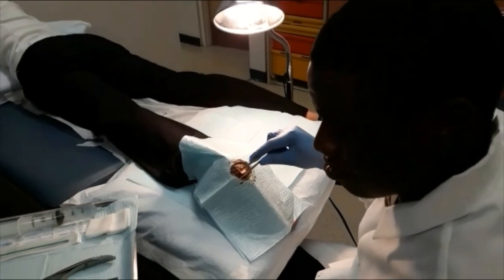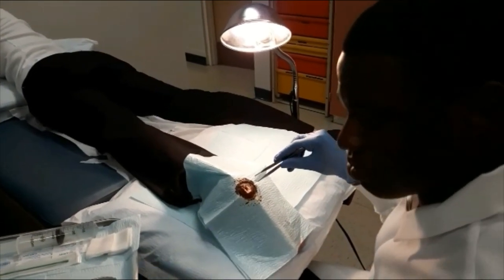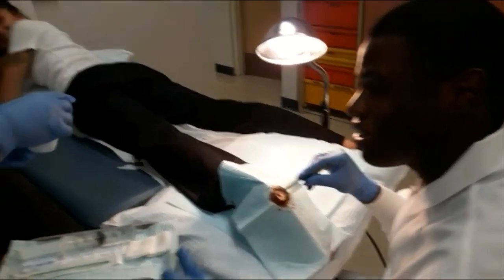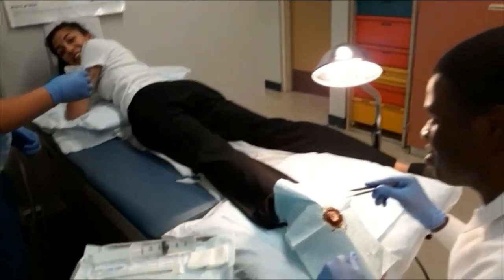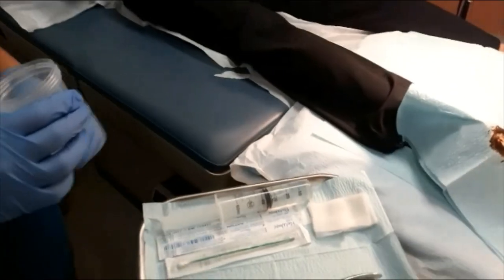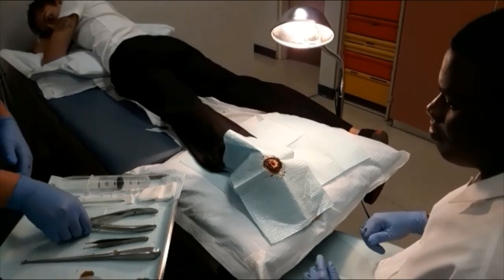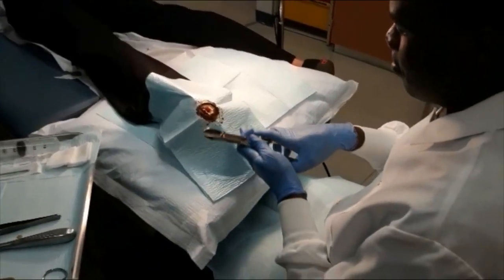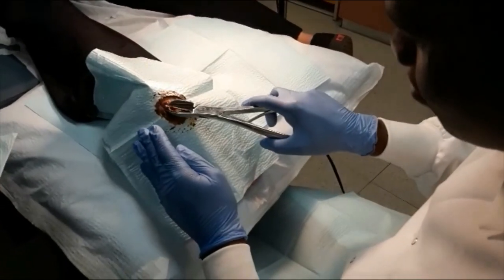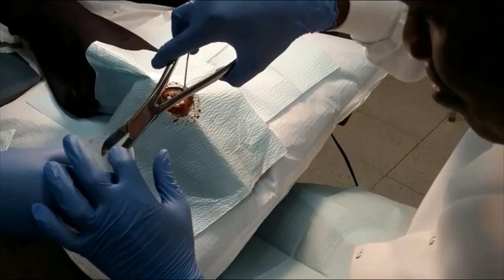Is that it? Is that the wart? Yes, can I see it? It's pretty cool, isn't it? Yeah, it was a big one. Wow, look at that. After the wart has been removed, the physician uses the surgical tissue nippers to clean up the excess skin from the edges and any possible remnants of the wart.